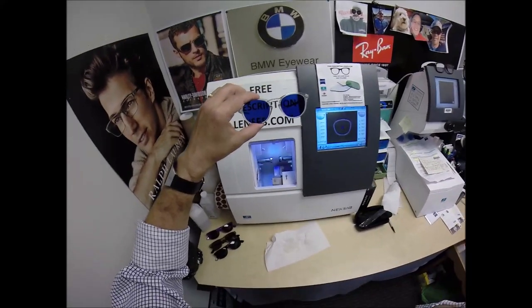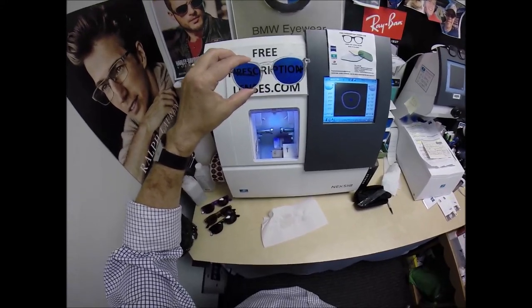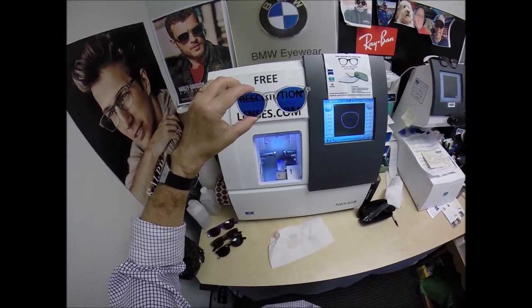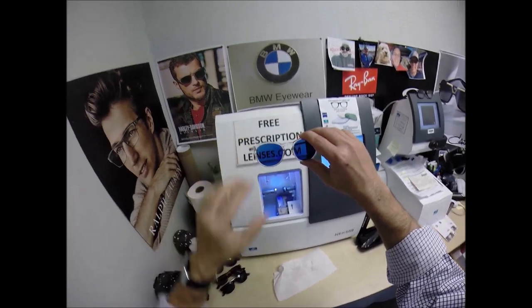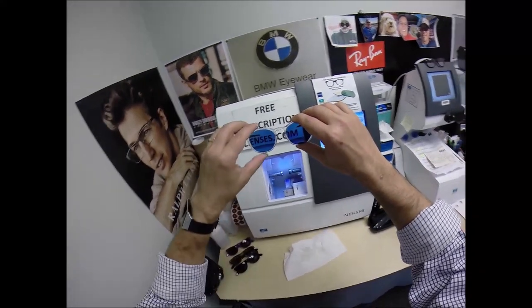The only time the photochromic transition lenses won't darken is if you're behind the windshield of a car. Your windshield absorbs the sun's harmful ultraviolet rays. It would cause your upholstery to rot or your dashboard to crack from sitting in the sun all day. And that's why they don't turn dark in a car.